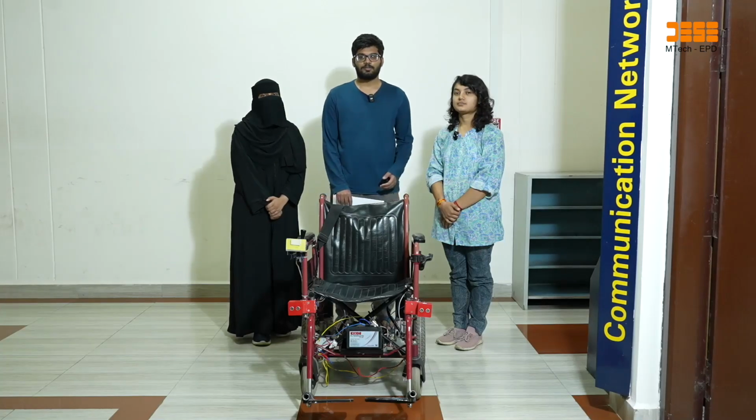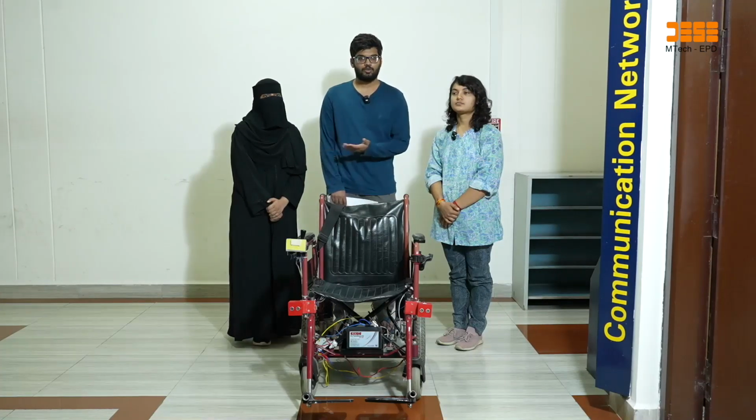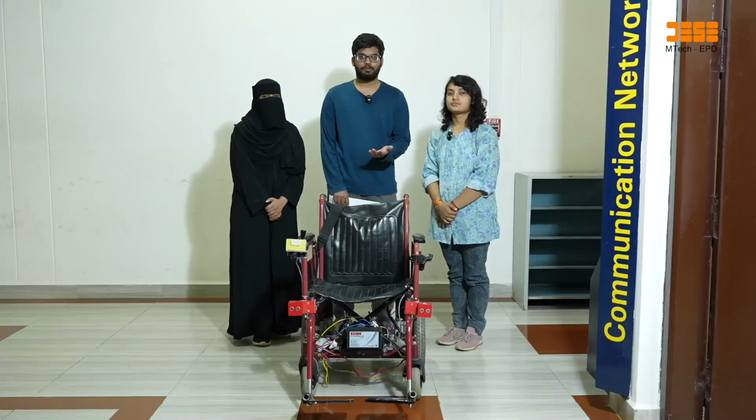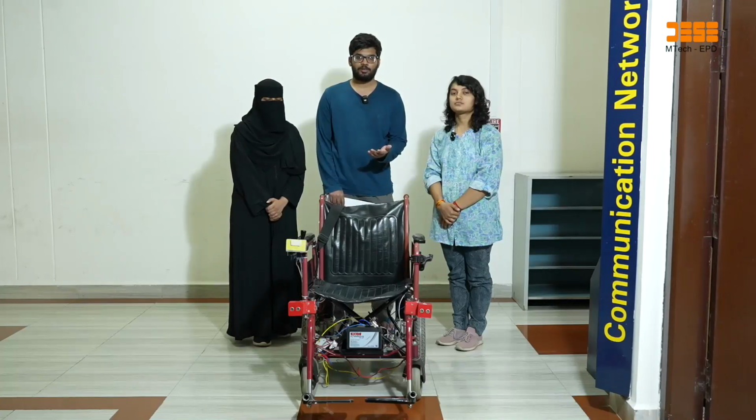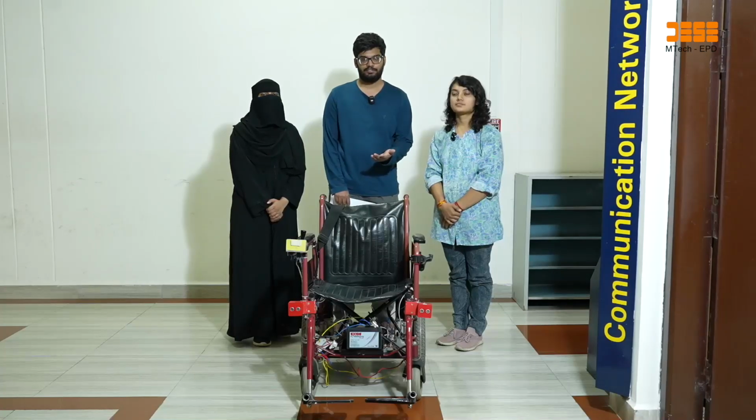Hello, this is Manav, and these are my colleagues Noora and Bishwapa, and we are going to present our Mechatronic System Designs mini project, that is autonomous steering control of wheelchair with drive.